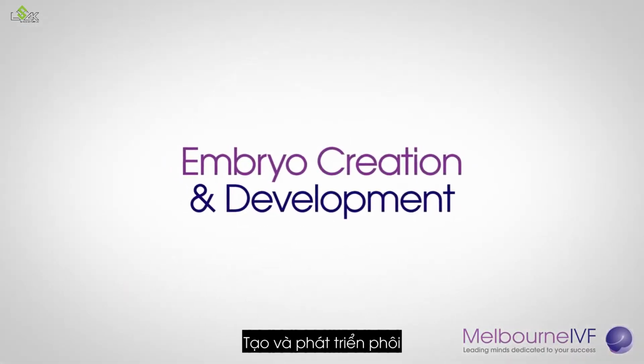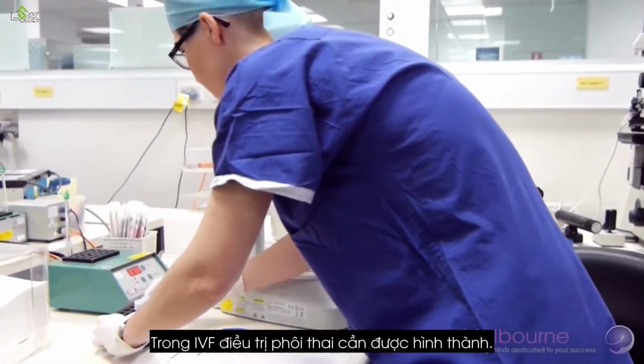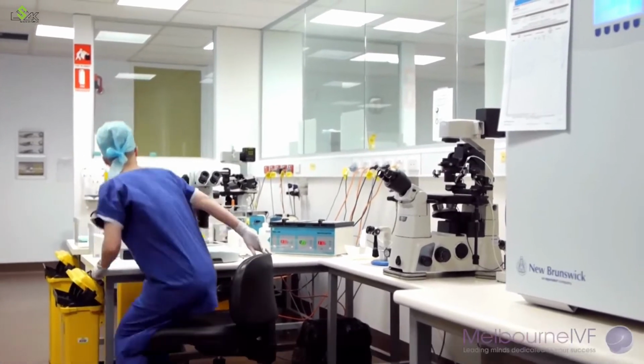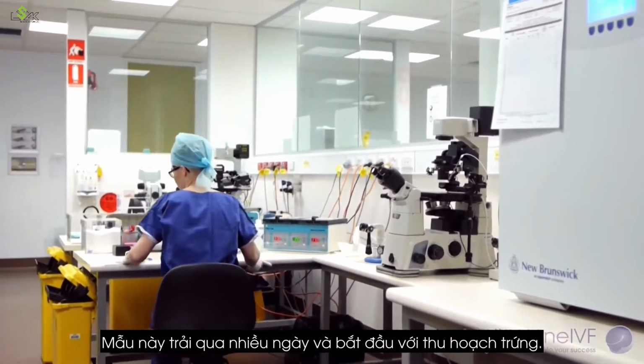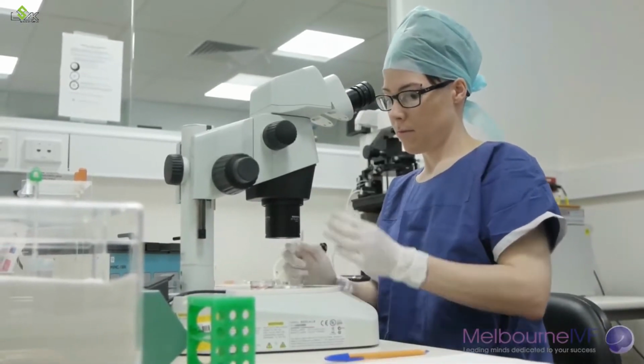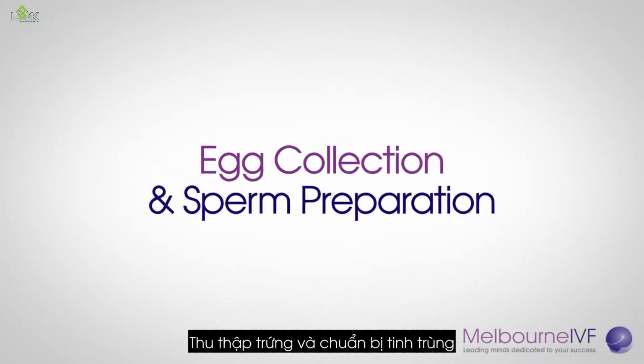Embryo creation and development. In IVF treatment, an embryo needs to be formed and develop before it can be transferred to a woman. This involves many steps over several days and begins with the egg collection. Egg collection and sperm preparation.